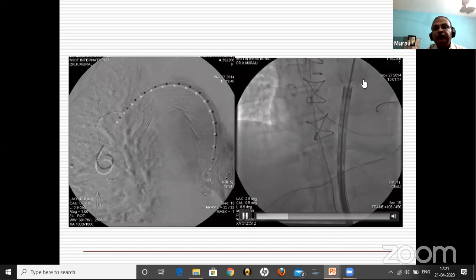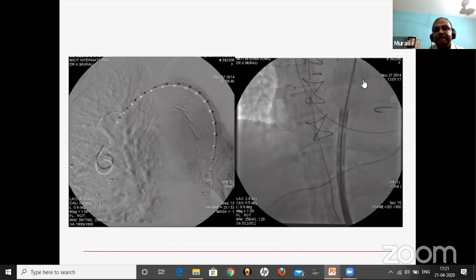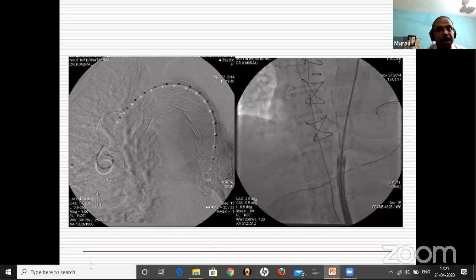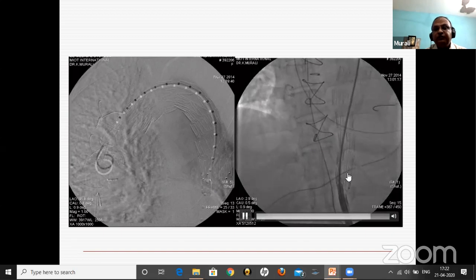You can see here after the second graft is placed inside, here when it is in the false lumen, how it pulsates, and you will see here as it comes into the true lumen how exactly it molds to the true lumen. So you can see here, this is now very well within the true lumen. So it's very, very important. You cannot afford to make any mistakes.